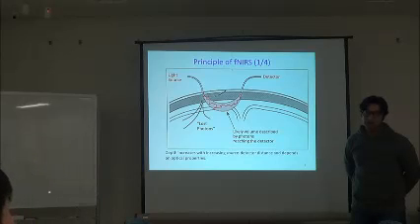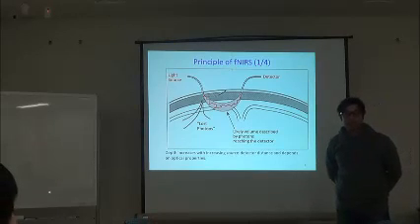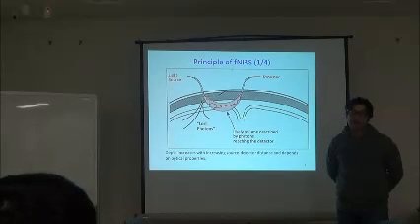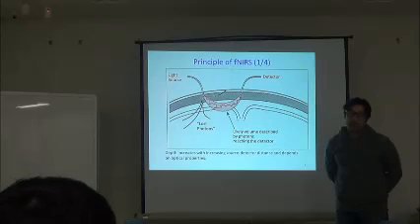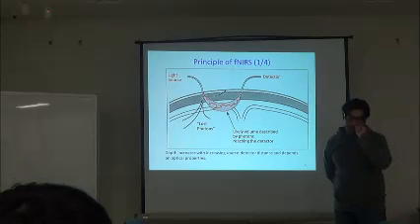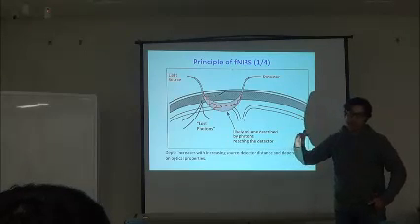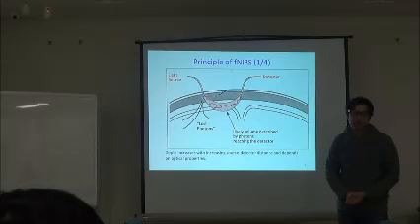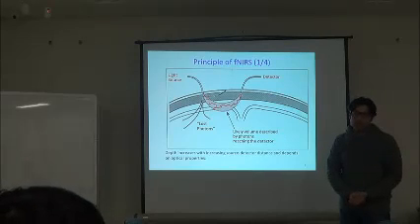Most commercial machines use the optimal power, not the maximum. They even don't want to go to the maximum. They leave some margin. Usually, maximum up to 15 milliwatts.